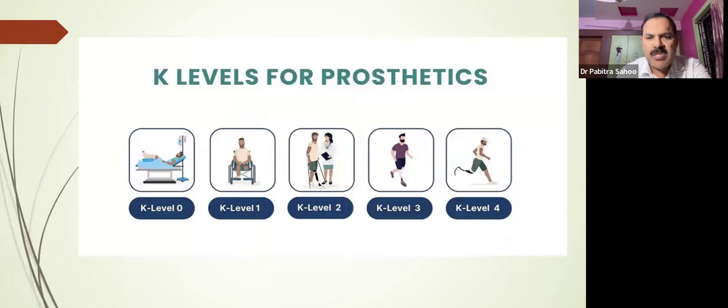How the patient will behave as per the K level, whether a community ambulator or a home ambulator, does not depend only on the patient himself. To some extent it is related to us, in how best the prosthesis can be fitted to improve the K level of an amputee patient.